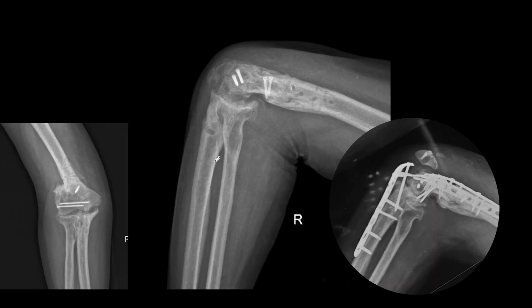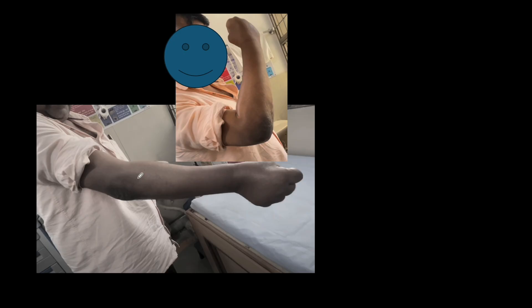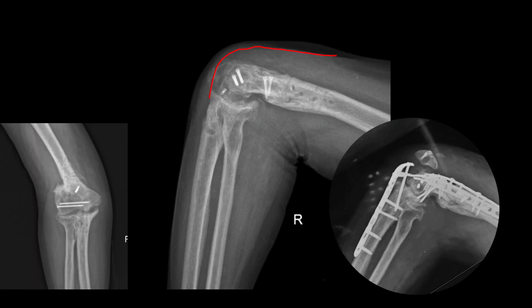Ultimately this patient underwent implant removal for improving range of motion. You see the fragment while getting resorbed — similar to the previous case — but you see the contour of the triceps: it is not getting kinked or retracted proximally. That means it is in continuity with the proximal ulna. Unlike the earlier case in which the contour of the triceps had been lost because of retraction of the proximal fragment. The outcome is going to be good even though the radiograph might not appear perfectly anatomical, because these are revision cases — you don't expect good radiographs, you expect good functional outcomes.